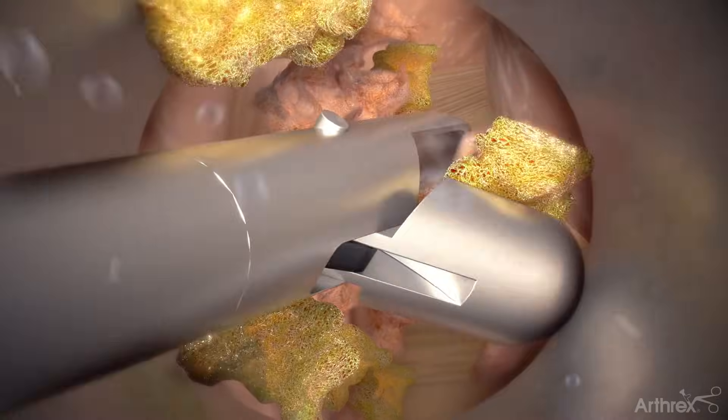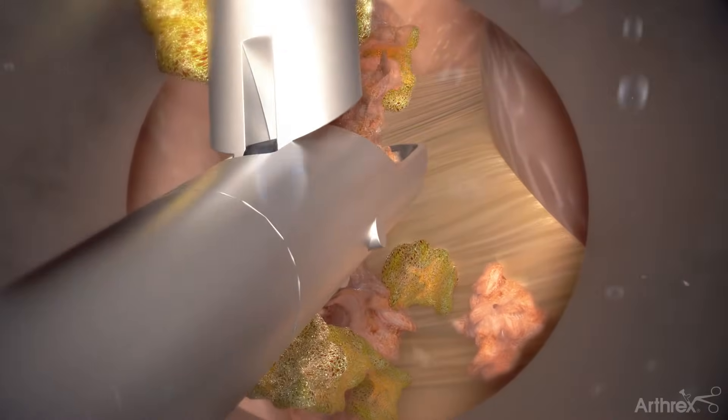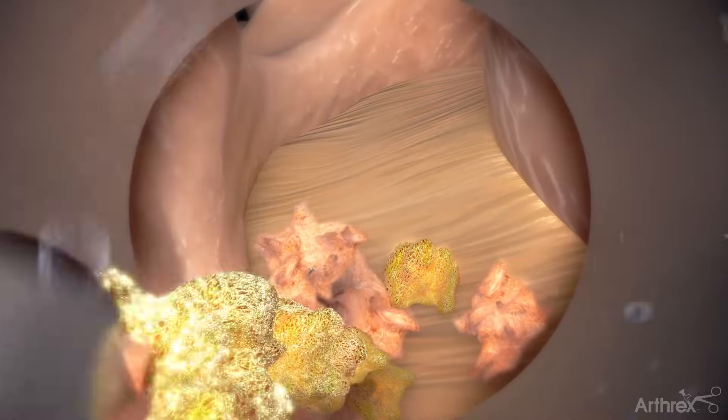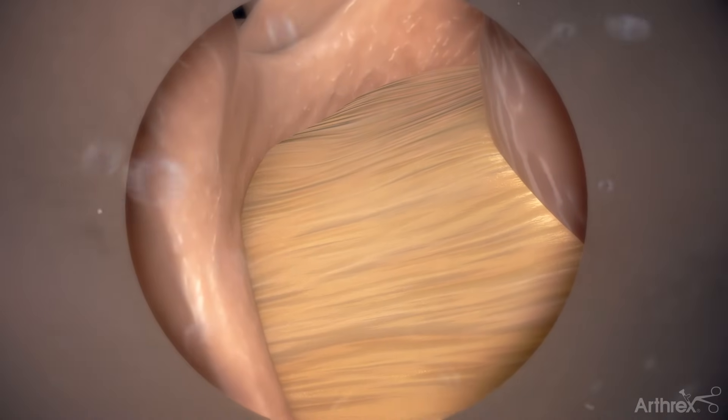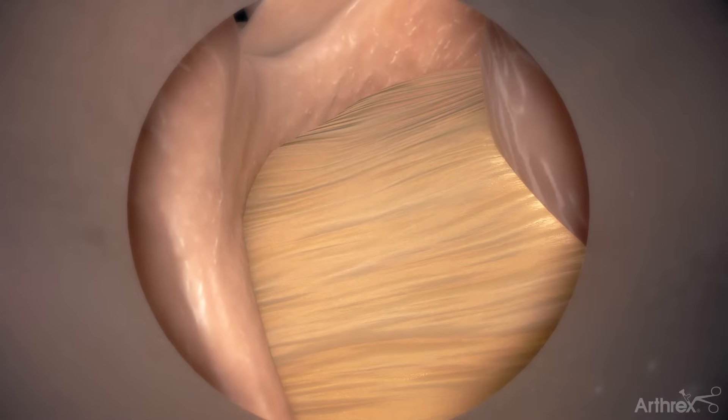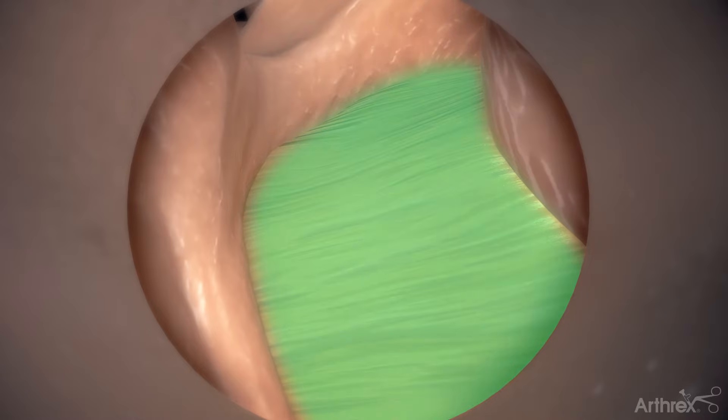Once the endoscope is inserted, use grasping instruments and the electrosurgery probe through the endoscope's working channel to remove excess tissue and coagulate blood vessels. Expose the base of the spinous process, the contralateral laminae, both caudally and cranially, and the ligamentum flavum.